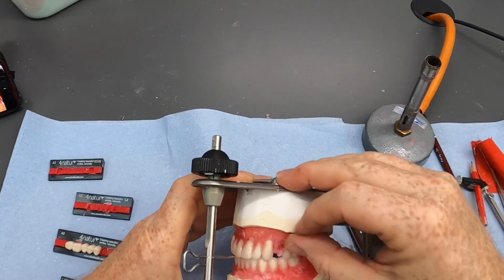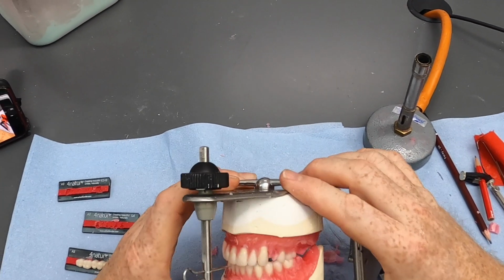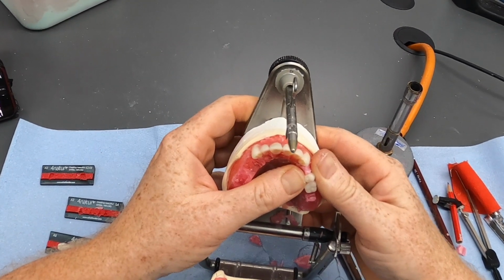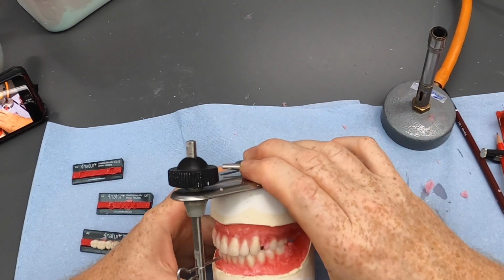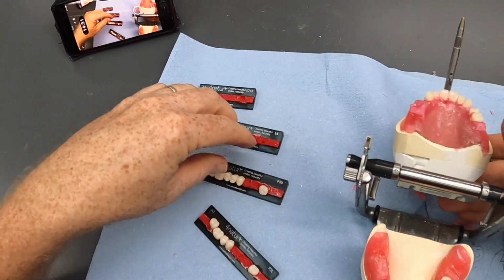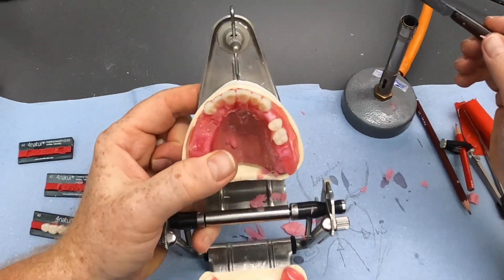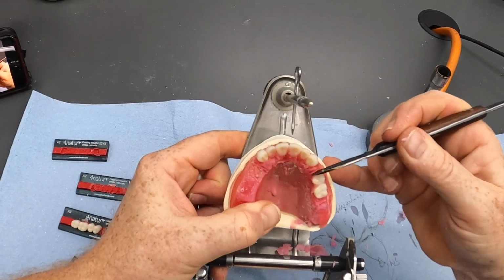So there we are, we've got the 5 position now. We've got contact between the upper and lower teeth. I'm going to check these in excursion in a second. Just give that a bit of a tweak and bring that palatal cusp down a touch. So with something like this now, and then we'll have a 4 put into position as well. Just going to soften my wax, it's just firming up a touch.